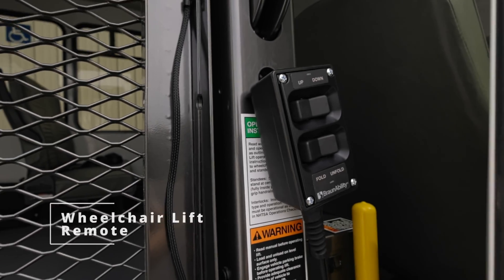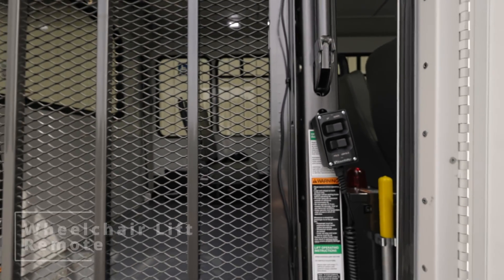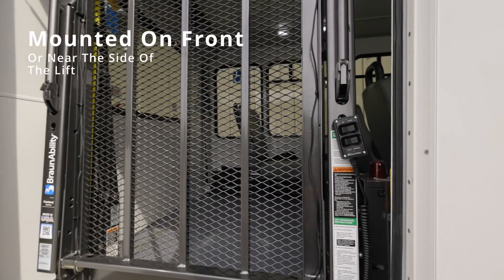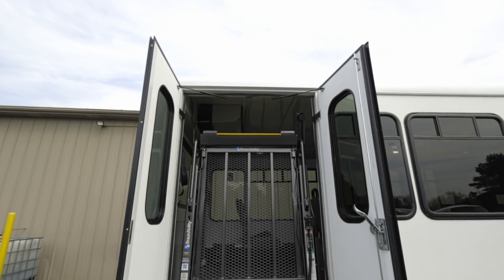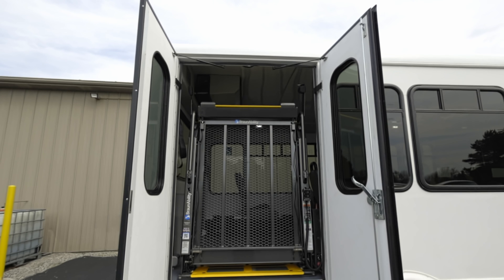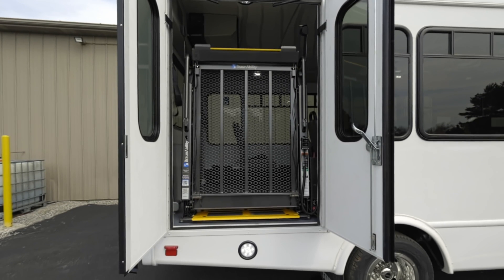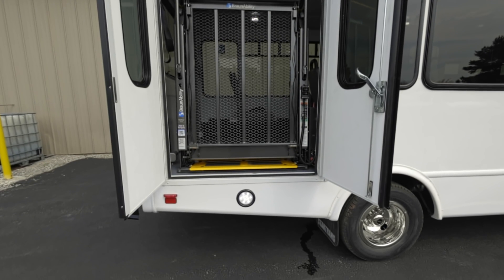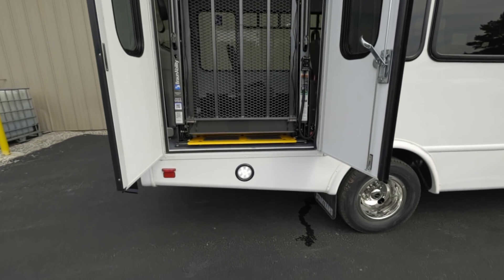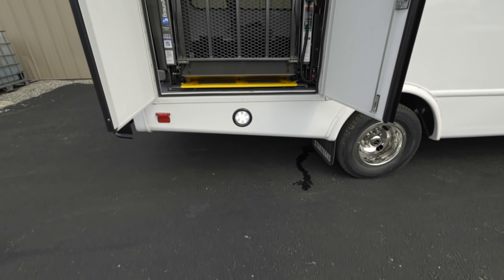To operate, locate the lift's remote, which looks a lot like the one shown here. It'll be mounted to the front or near the side of the lift. Before deploying the wheelchair lift, make sure that the surrounding area is clear and that the vehicle is on level ground. It is important to make sure all body parts and objects stay clear away from the lift during operation, so as not to obstruct its movement and to avoid damage or injury.